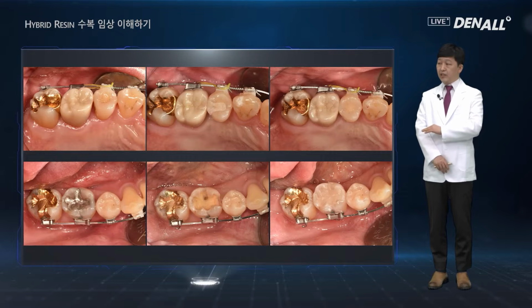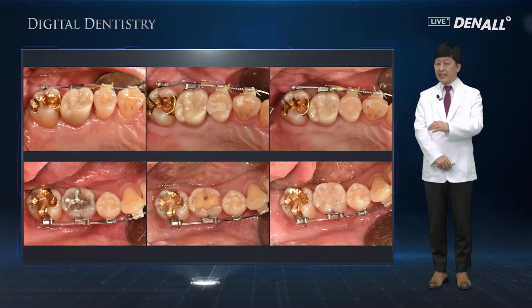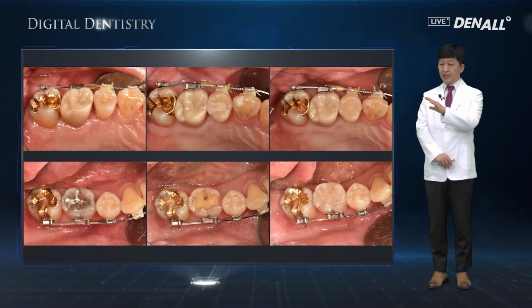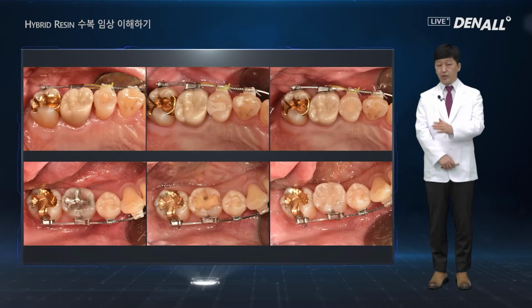Another advantage is that patients with orthodontic appliances, if you want to take impression the traditional way, you need to remove wire and block out the bracket using different materials, and only after that you can take impression. However, if you use scanner, you take scan, and on the next day, without removing all these appliances, bonding can be done, and restorative process can become very efficient.